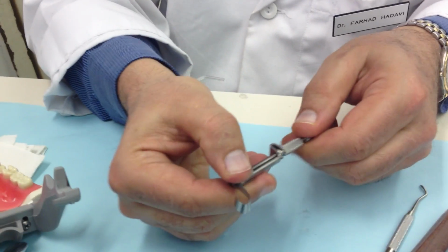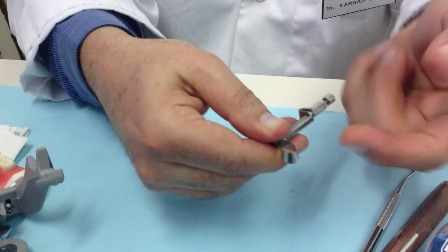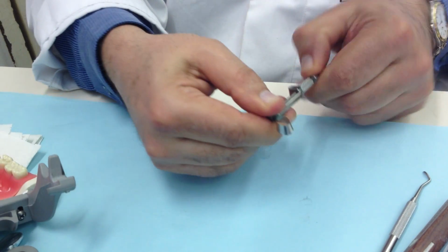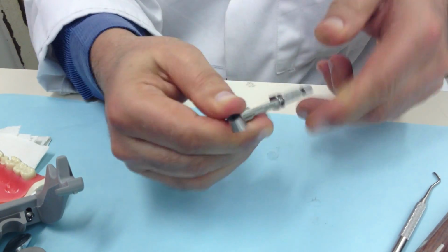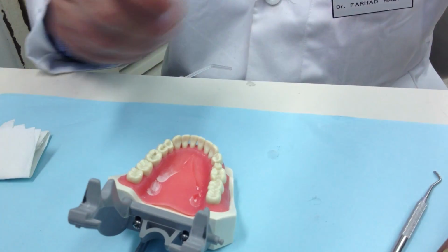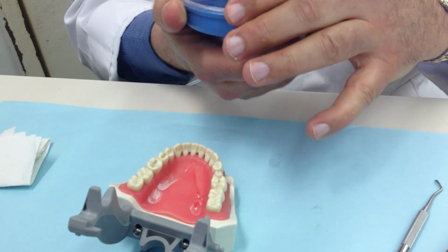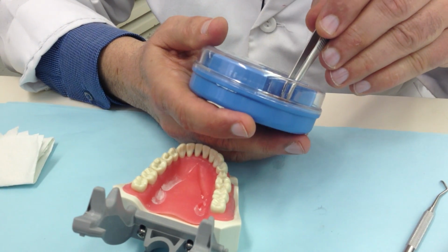Now I tighten this one. You can see when I tighten it, I hold this one down nicely. I don't want it halfway to be pushed down. I tighten this one nicely, correct? Now, this is ready. The next thing that I have to do, I have to try my wedge, to see which wedge satisfies the requirement that I talk about. I want to have a good fit.